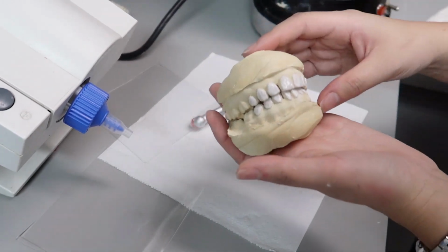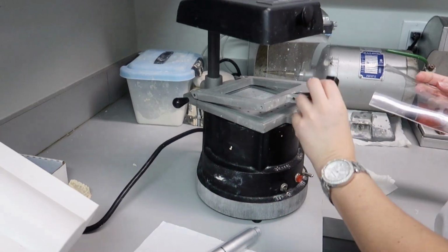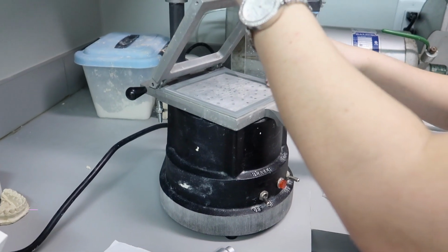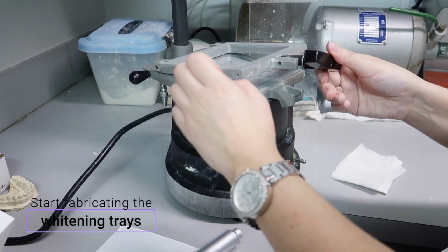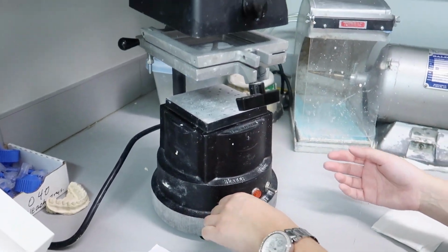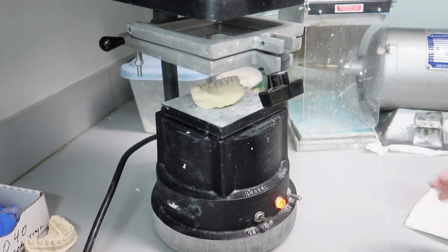We're going to go ahead and start getting ready for the actual bleaching trays. This is our little standard machine. I don't love it, because for those that are familiar with the Ministar S or something like that, that's a great one. Yeah, that's a fancy one, but it's worth nagging your boss to get it. So we're going to wait until that heats up.